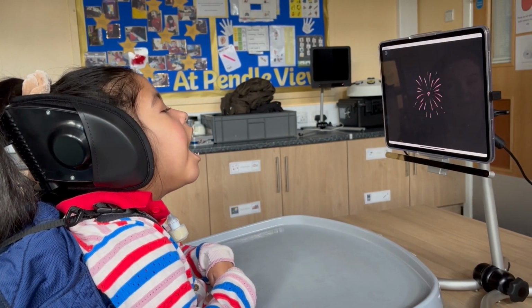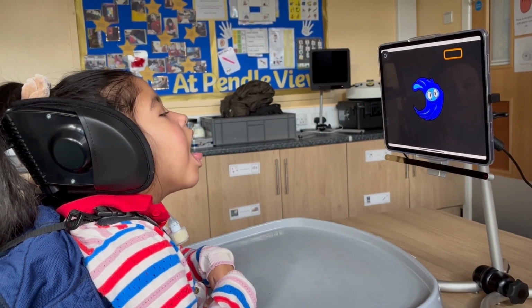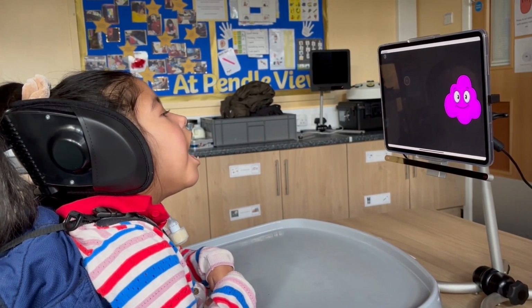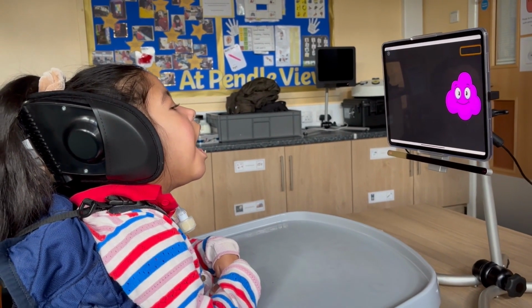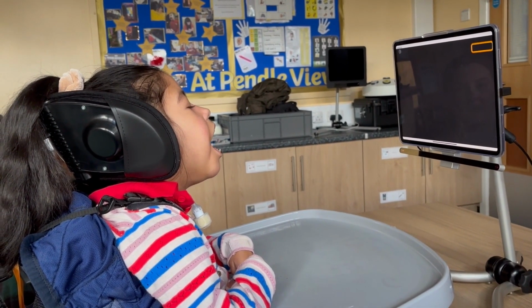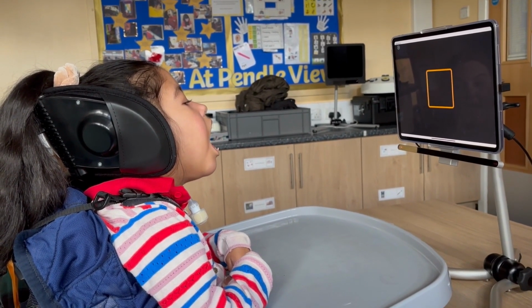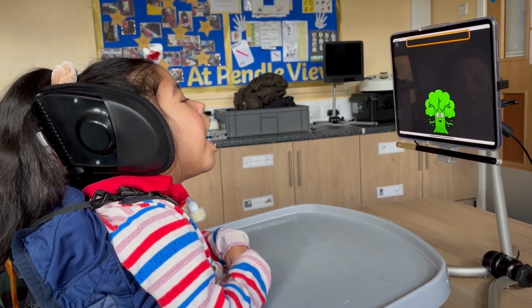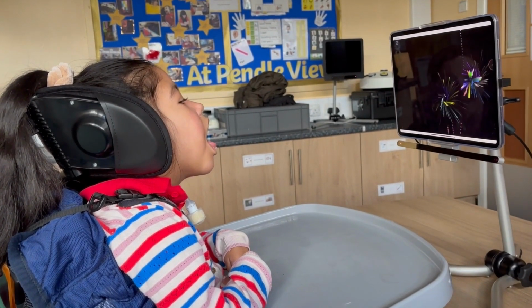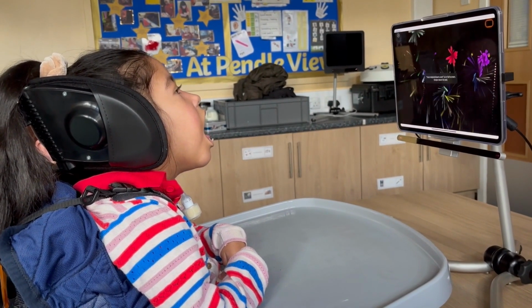So in this activity, you can see the objects not only appearing in the middle, but also at the sides of the screen. A pink cloud. So it's a bit trickier for us now. And also above and below as well. She knows that. Superstar! Wow! Absolutely fantastic.